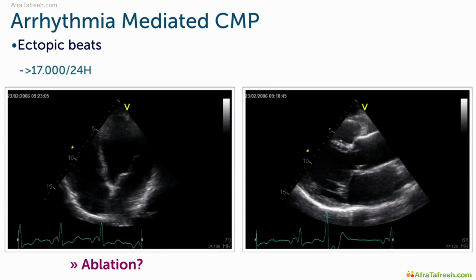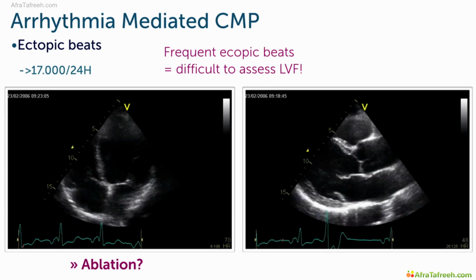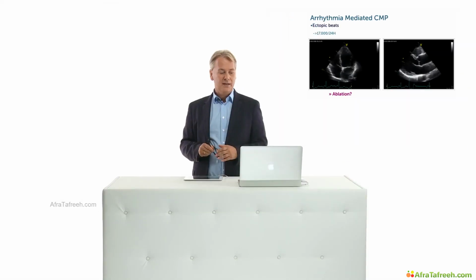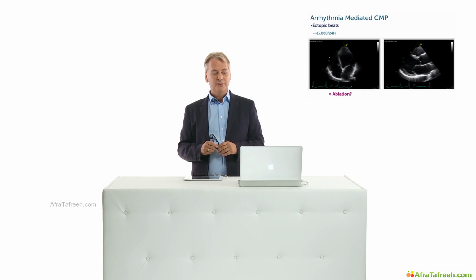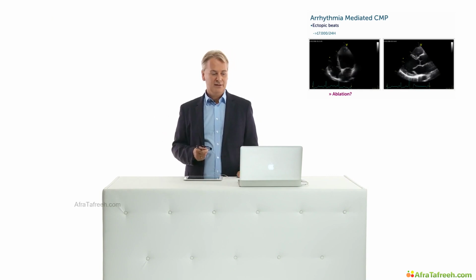Again, be aware that it's very difficult to assess left ventricular function in patients who have, for example, very many ectopic beats, as in a bigeminus. So this is a form of cardiomyopathy you have to be aware of, and which I think is in some way underestimated with respect to its prevalence.